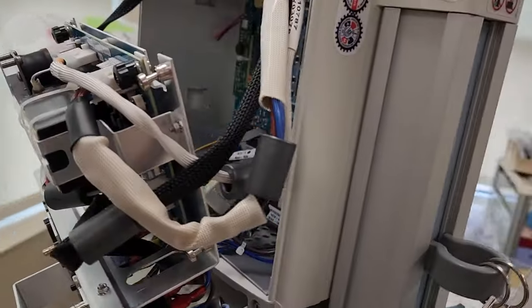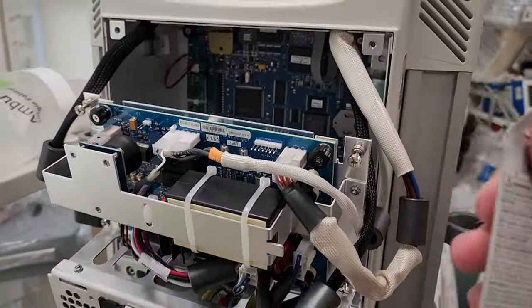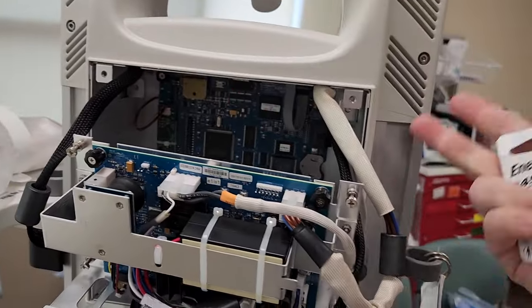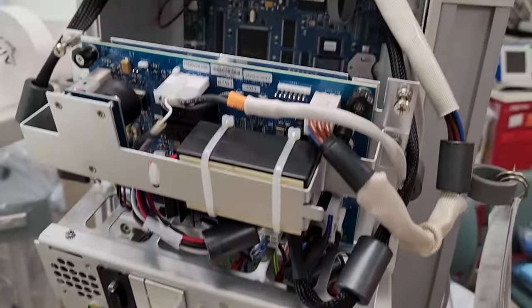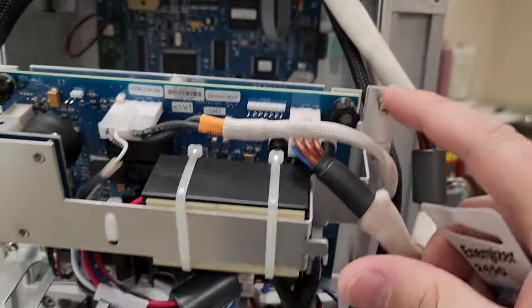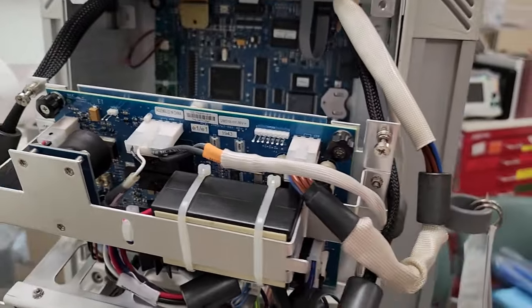All right, so this is the insides of your radiant warmer. Now, there's two fasteners here that remove the upper panel. Make sure that you have the power off, okay? My unit is unplugged. So this little coin cell right here is located behind this panel. You got 1, 2, 3, and 4. You loosen those up, they're captive. Nice, I like how they did that.